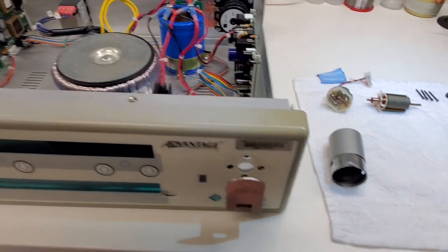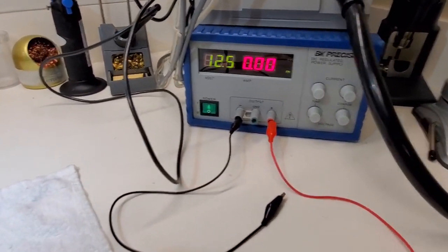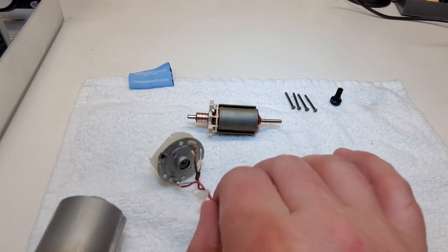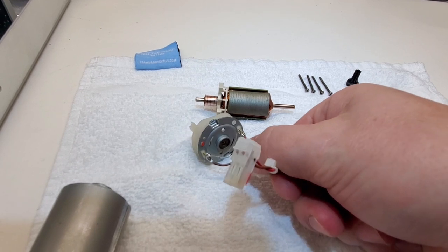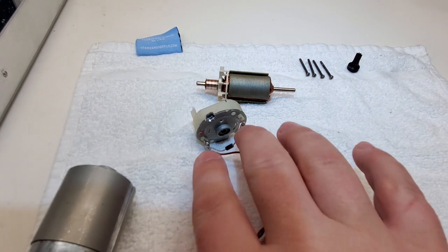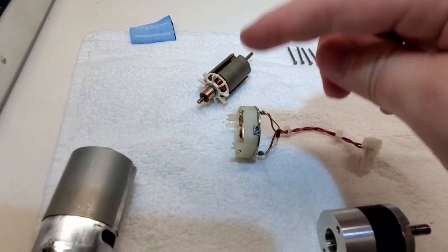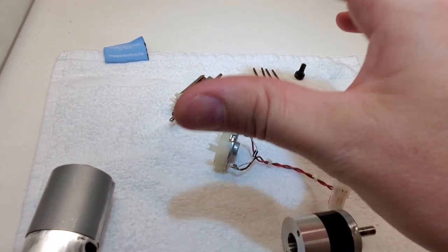But just in case, here's where we come over and we hook it up to our regulated DC power supply. And we can connect it directly. But because this is a medical grade motor, one of the things that you have to pay attention to is there is a shunt diode here on the back of the motor. Now that makes this a polarized motor, because normally a DC motor like this, it doesn't really matter if it spins one way or the other. It depends on the polarity of the input, obviously.